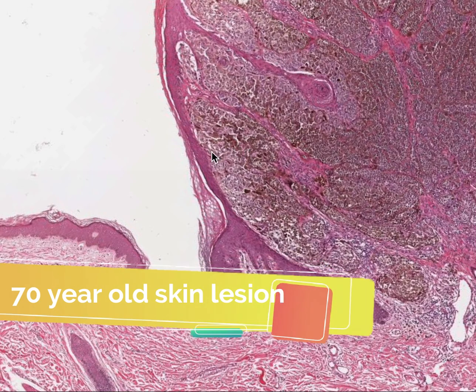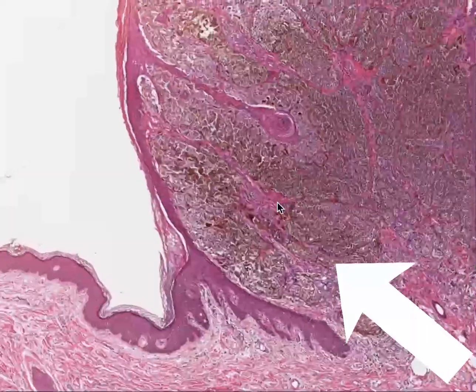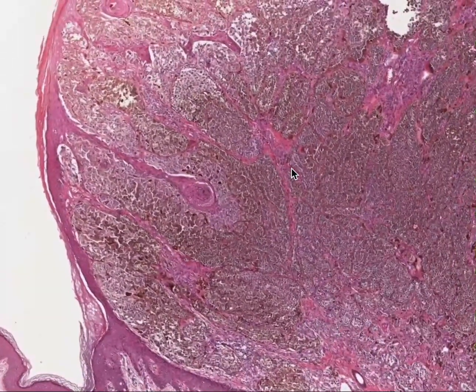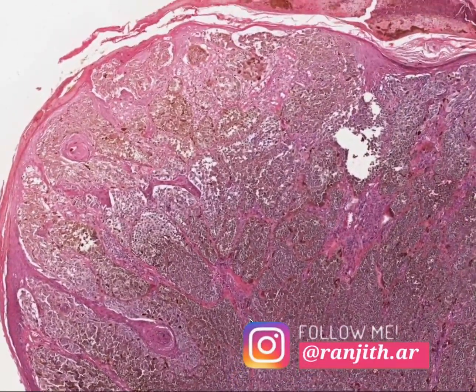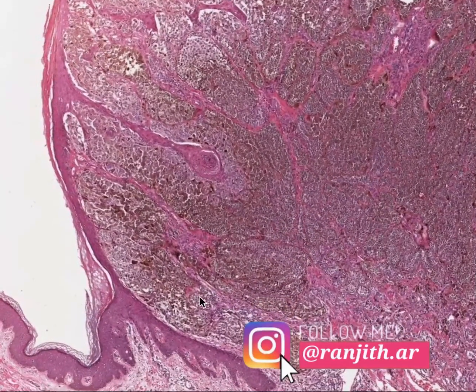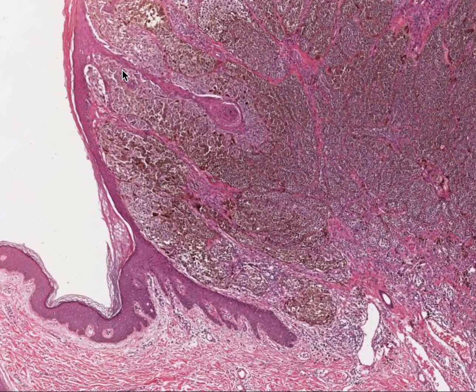This is a biopsy from that person. You can see normal skin of the stratified epithelium, and this is the lesion — there is something abnormal here. Some of you must have made the diagnosis already. Moving through the entire abnormal area, you can see lots of abnormal things, with the surface of the skin still visible on top. One characteristic finding is the pigment — you have lots of brown pigments here, which is one of the characteristic findings seen here.